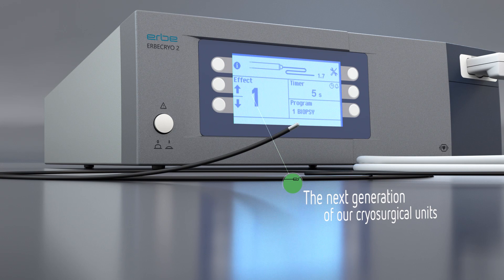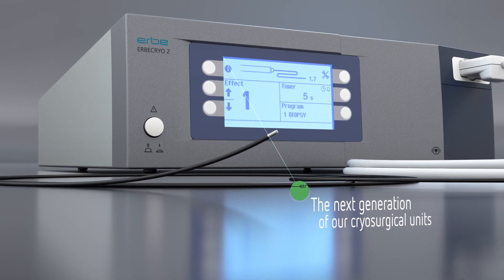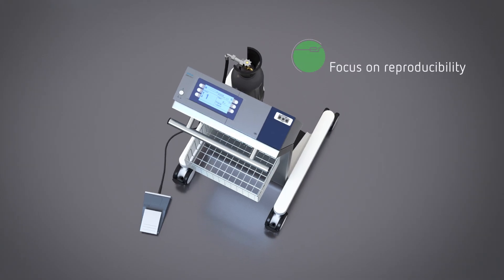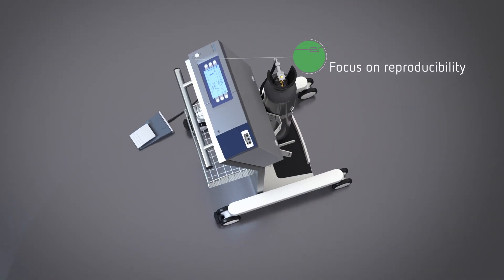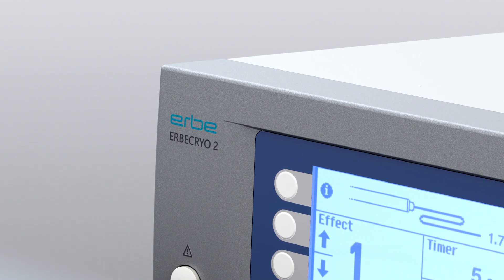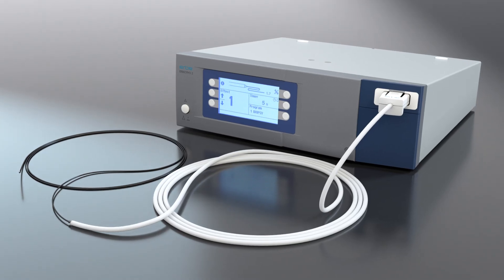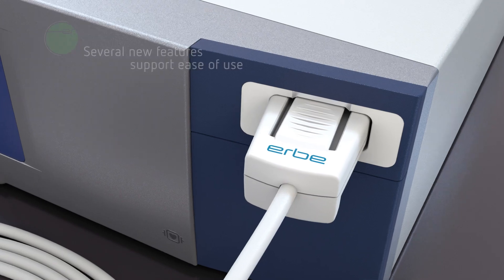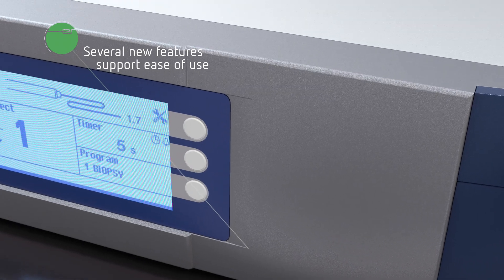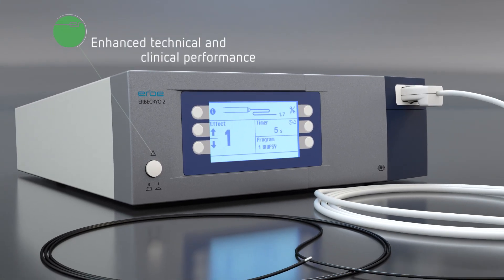The ERBECRYO 2 is the next generation of our cryosurgical units and was designed with a focus on improved reproducibility for state-of-the-art flexible cryo applications. In combination with the flexible single-use cryoprobes, the ERBECRYO 2 provides several new features introduced to support ease of use and enhance the technical and clinical performance.